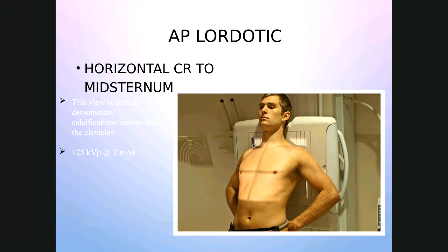The technique on this would be 125 at 2 mAs. And your IR placement would be however it would be if you were going to do an AP chest, whether it is lengthwise or crosswise. With this particular gentleman in the picture, I would guess they did him lengthwise.